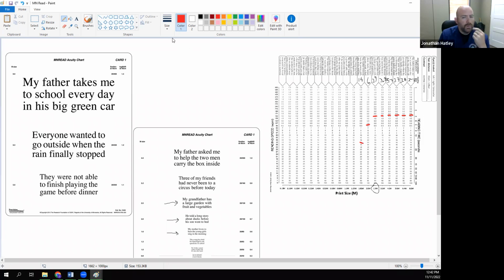What we're looking for, and what the clinician should be looking for, is an overall trend line. So for instance, you can see the patient is coming along pretty good, and then drops off again. And so what we're looking at is the optotype at which they were able to maintain their average reading speed. So what we can effectively do is say, this optotype is their maximum visual acuity with this add.